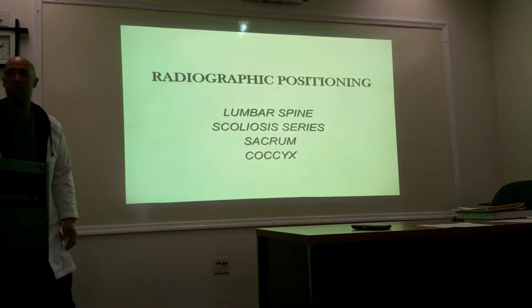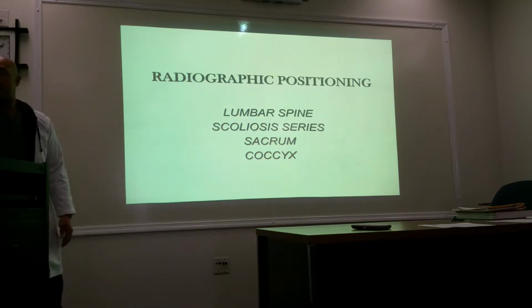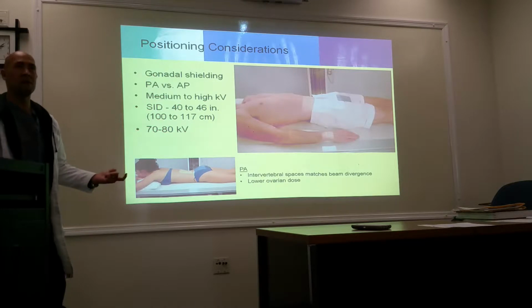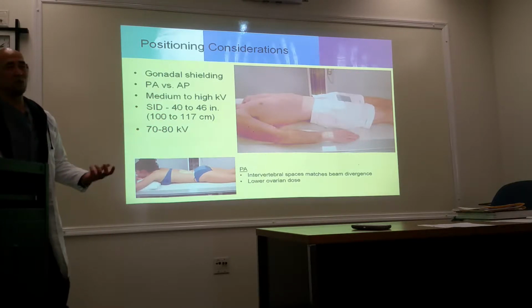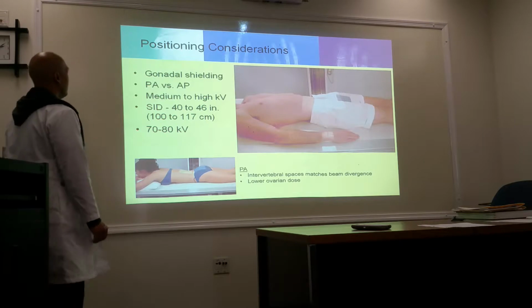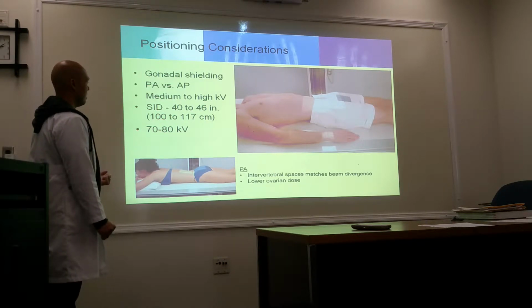All right, radiographic positioning for lumbar, scoliosis series, sacrum, and then the coccyx. Position considerations: gonadal shielding for males. How about females? No. Why not? Because their ovaries lie right in the area of interest, and males do not. Lucky us.